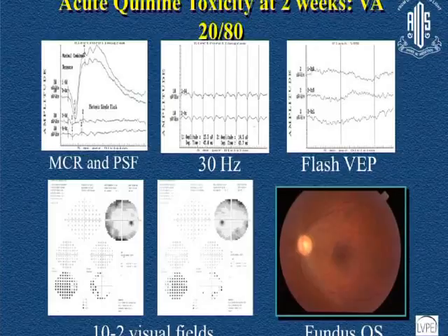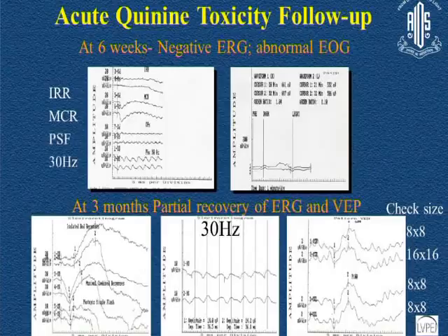But then after 6 weeks, it developed into a negative ERG. So, if we had seen her here, we might have thought she has CSNB. So things can change in certain situations. We should be aware that variation can occur depending on duration, dose, and at what point of time in the disease we are seeing. The same thing can happen in CRVO, before Avastin and after Avastin. So we should be aware that things can change.